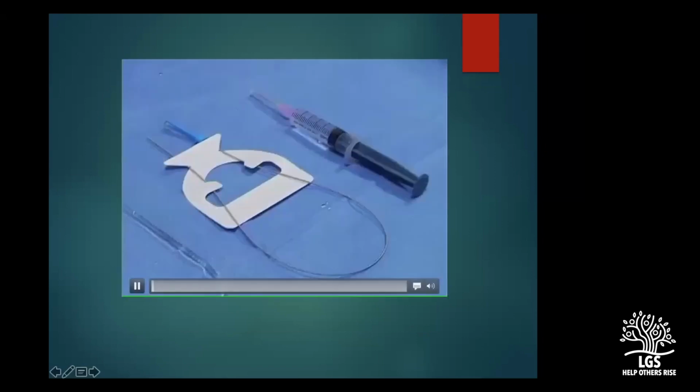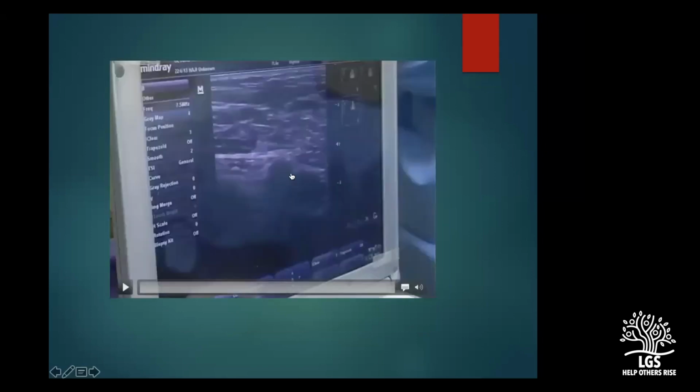We set the trolley up, and quite often we use ultrasound guidance because most of these patients are thrombocytopenic. It actually helps us, so that a double wall puncture is avoided when you use the ultrasound. In patients with low platelets, the bleeding complication is fairly minimal if you use an ultrasound-guided puncture for a certain group of patients who have low platelets.